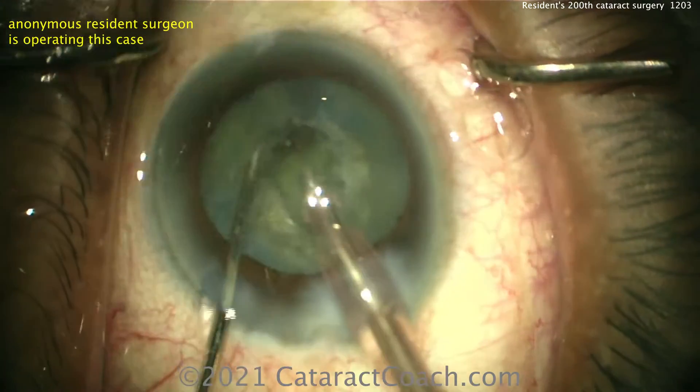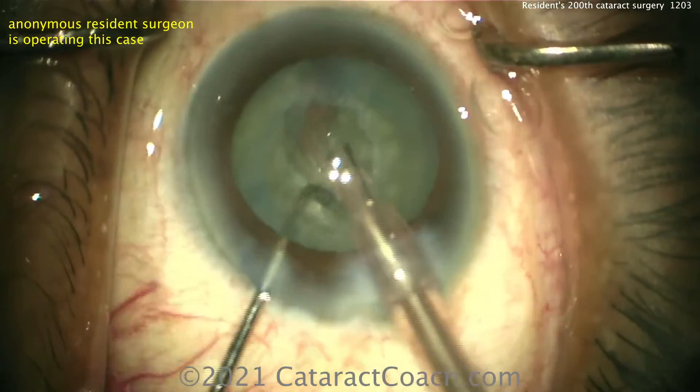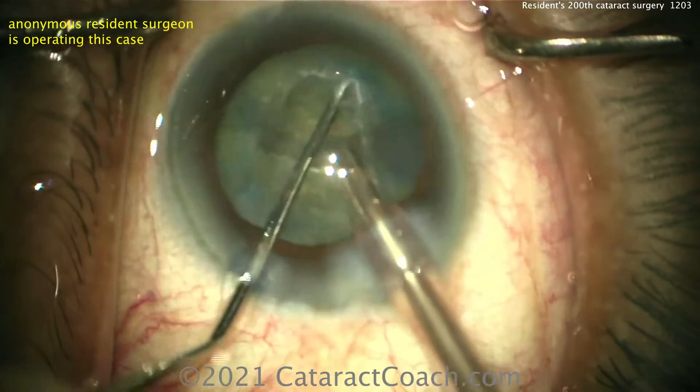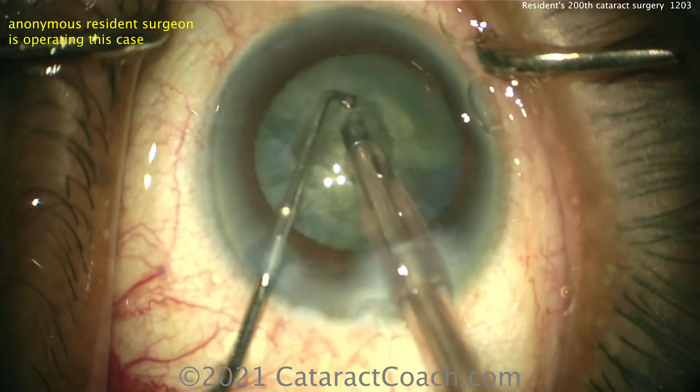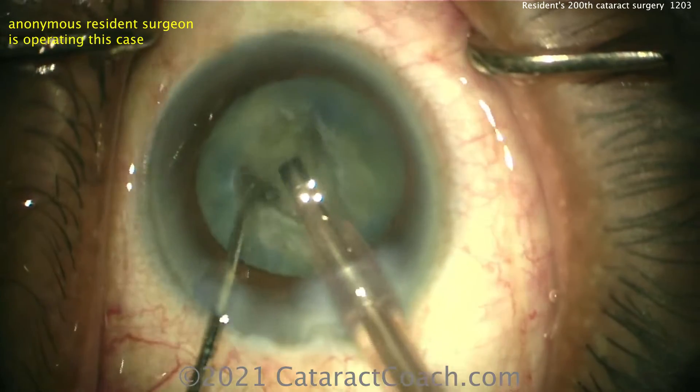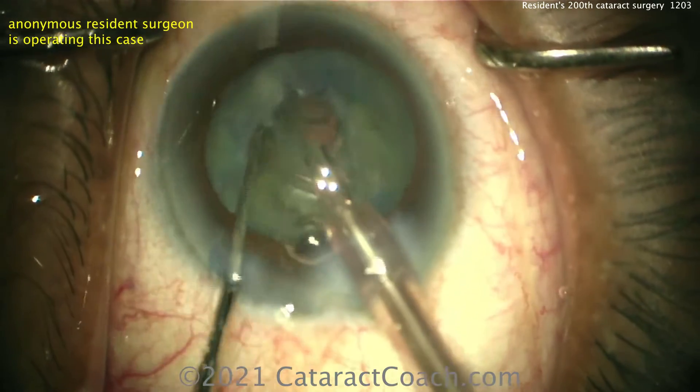This is a good stop-and-chop technique, chopping in the bag. The nice part of making that initial groove is that you have a place to deeply embed the phaco tip, and the chopper can go around and chop off little pieces. Making good short work of that first half — all looks pretty good.